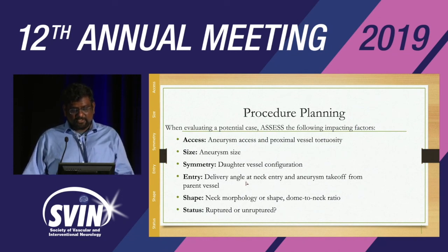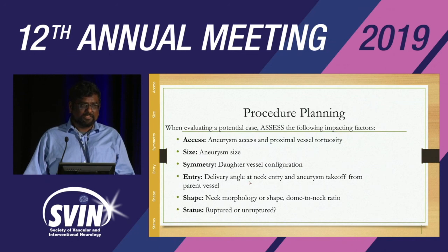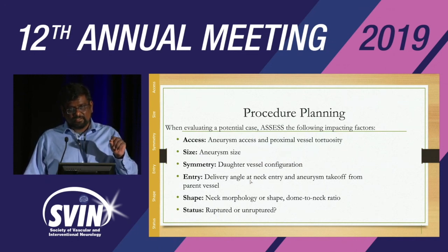The other important item to consider is the angle at which the aneurysm comes off the bifurcation, because for a couple of reasons. One, to track the more robust VIA system, then you have to plan ahead. Two, when you detach the device, again, there are some nuances that you have to follow.